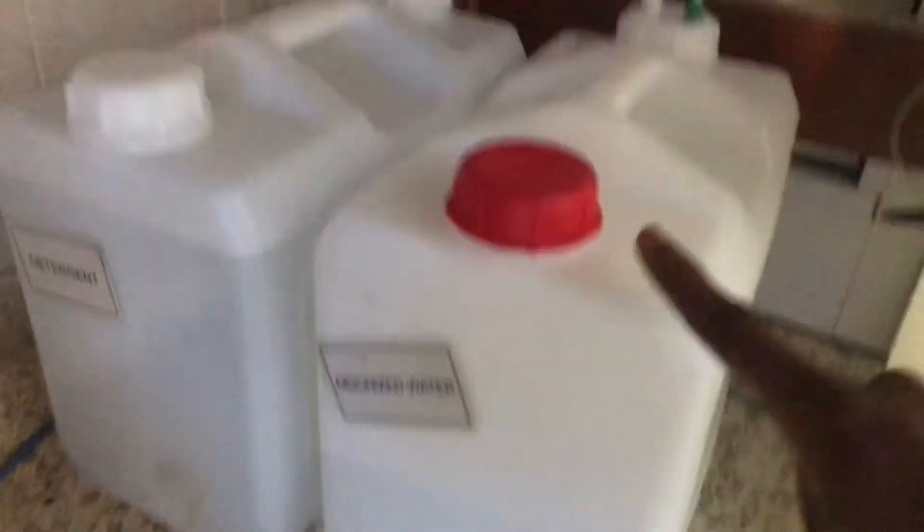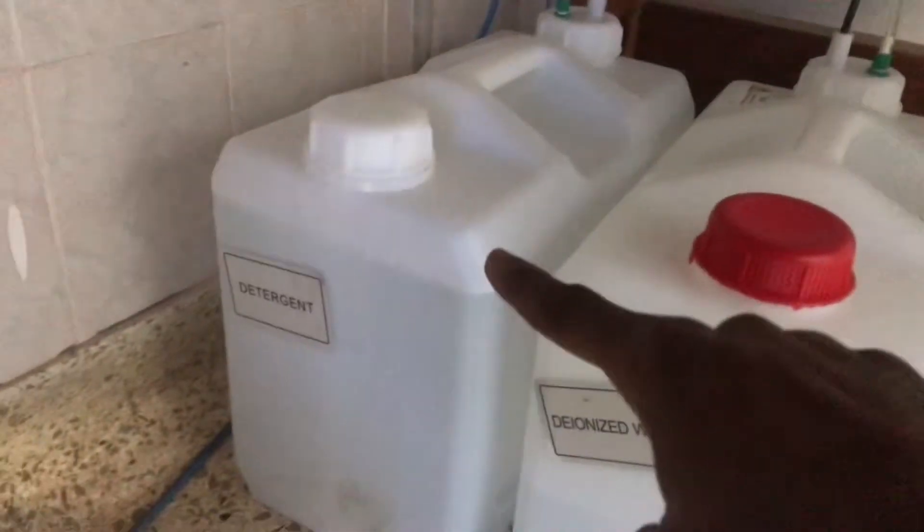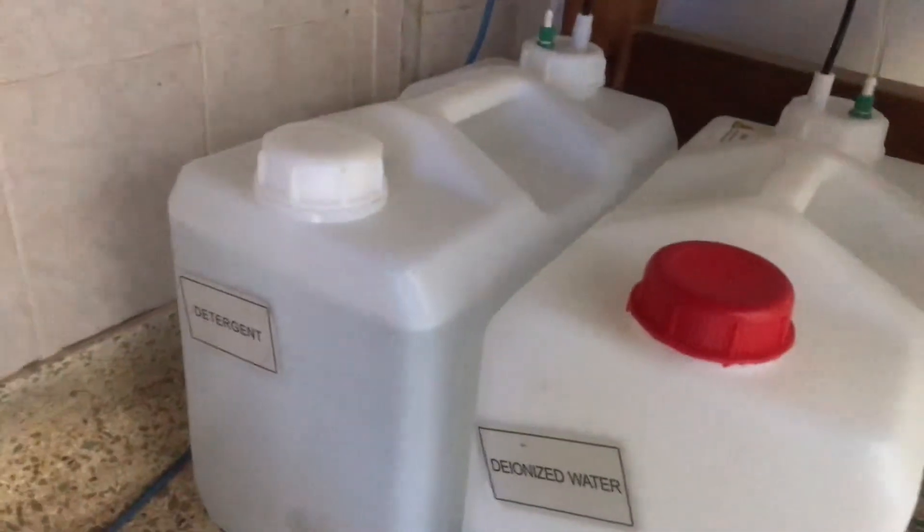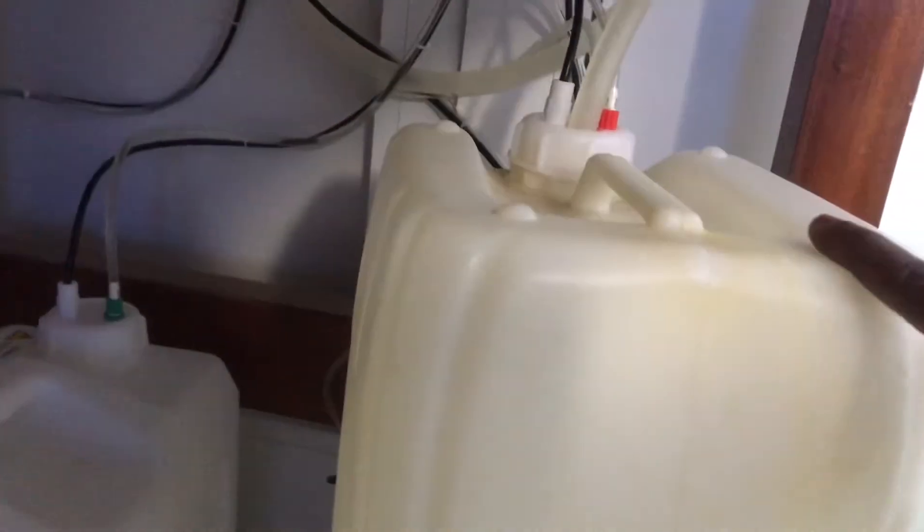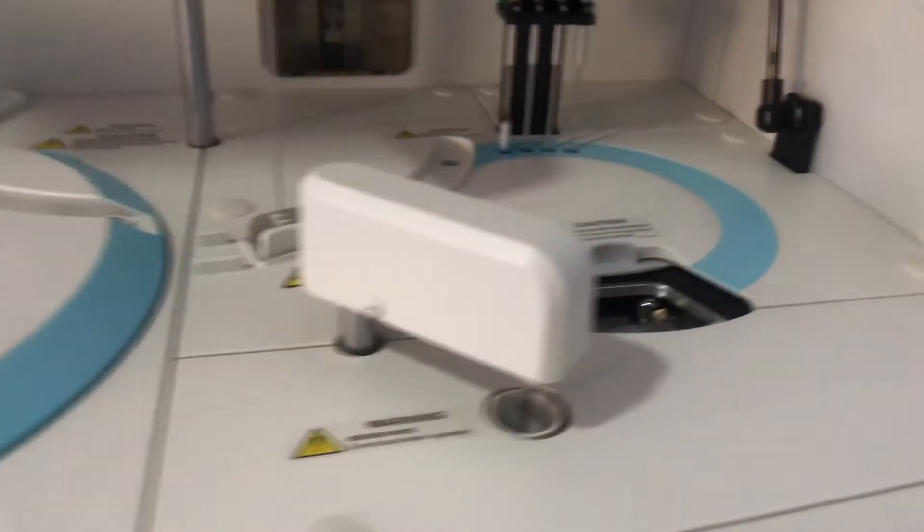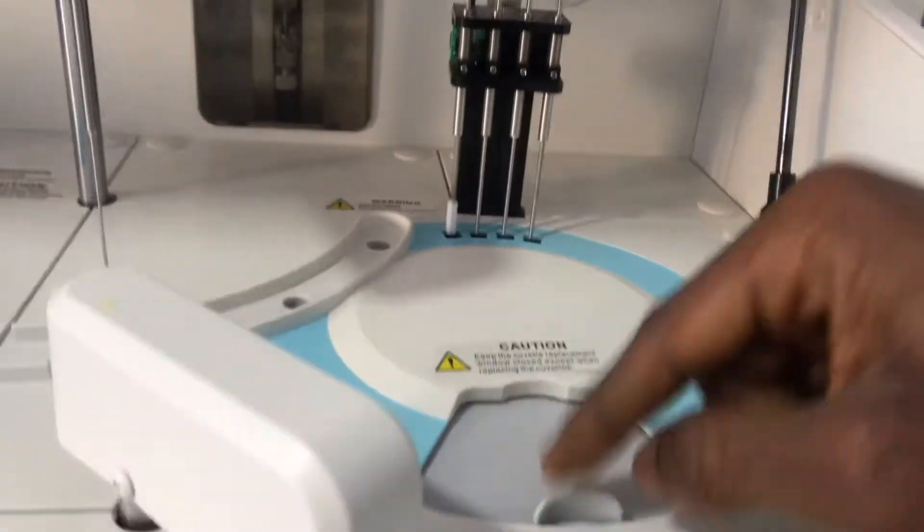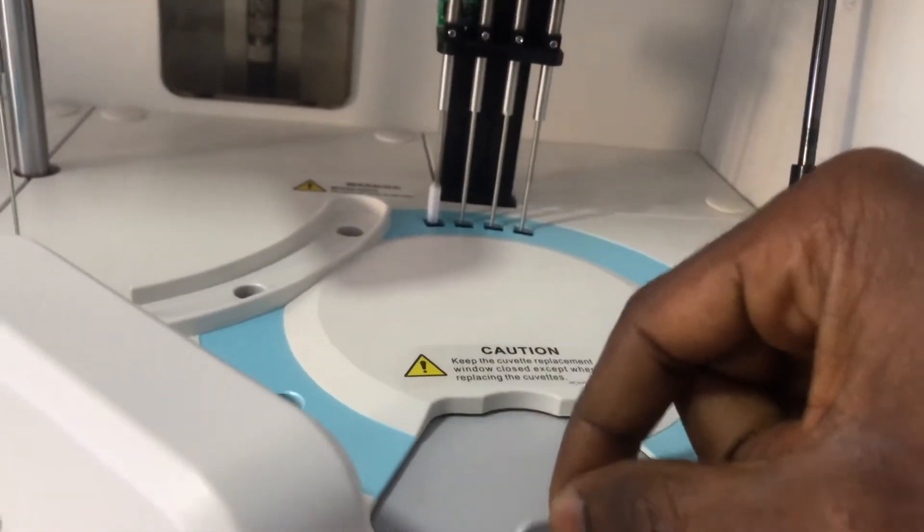Let me show you the external containers. Here we have the deionized water, here we have the detergent, and this is our waste container where all the waste comes in. If you observe, you realize this is the sensor and this is the tube that the deionized water passes through—same for this, and then same for this one.